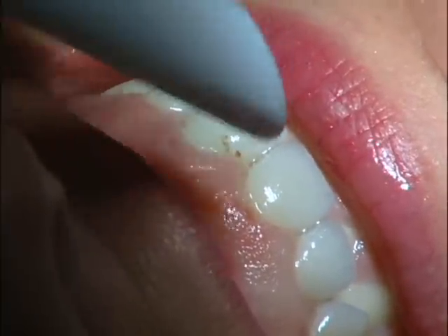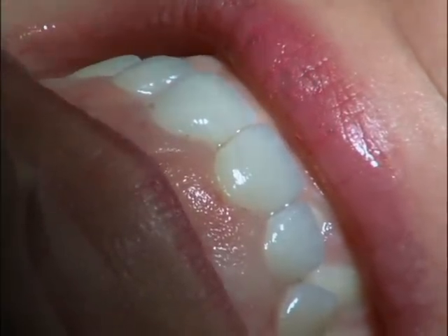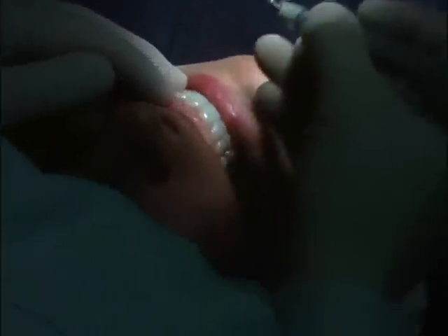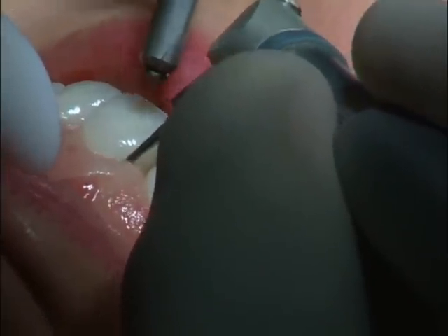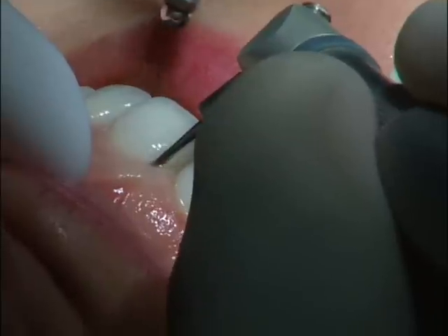So there's our tissue recontouring, trying to make the centrals the same size. Now I'm just going to take and slide this into the sulcus. So now I'm down inside.